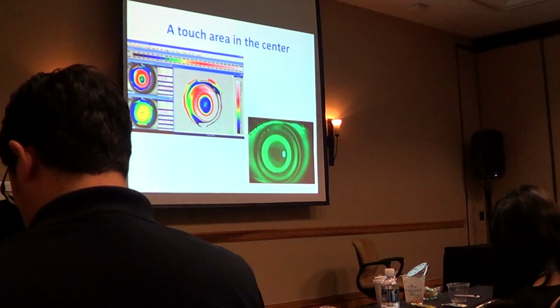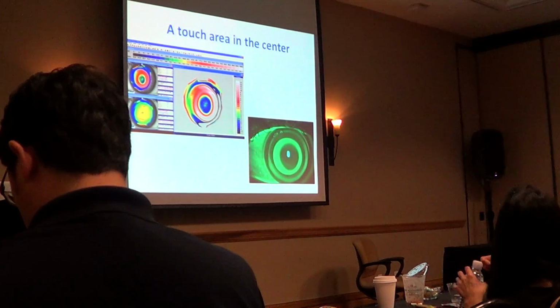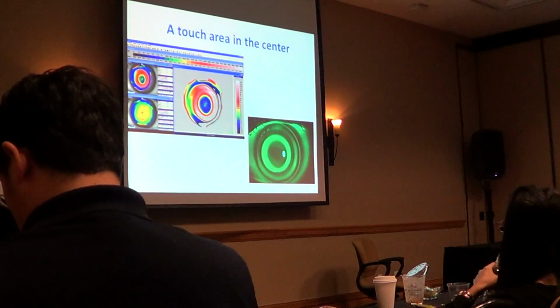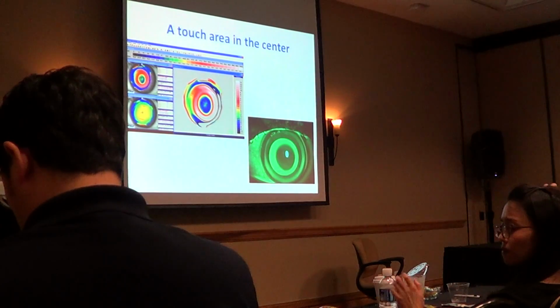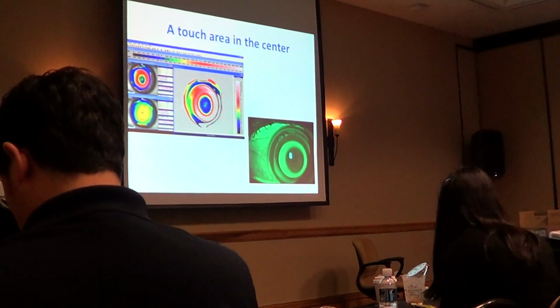But the central island that John Mumford describes, like a central lens, a very steep fit, I don't remember having any patient like that in my life. But maybe other lenses have that. Maybe. So I couldn't assure that. But in my experience with my lens, it never happened. Okay, but it's true. Fake central island.